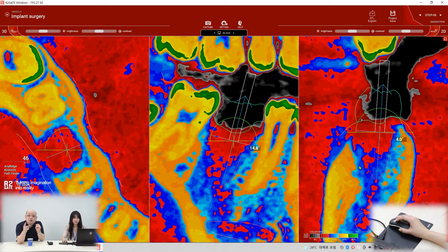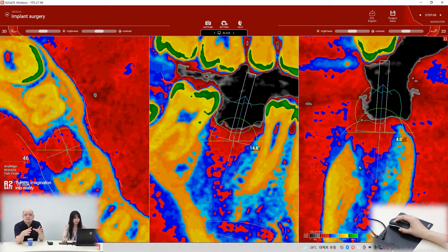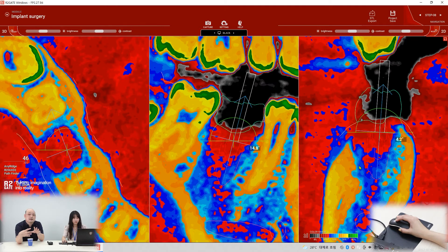The implant position is very important — which part of bone is in contact with the implant surface, that's more important.